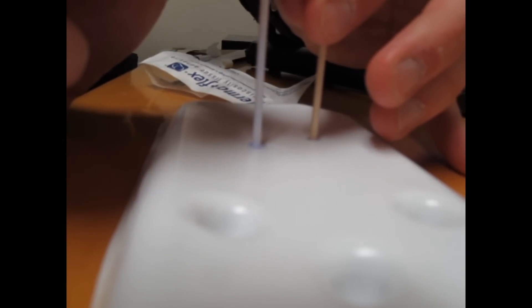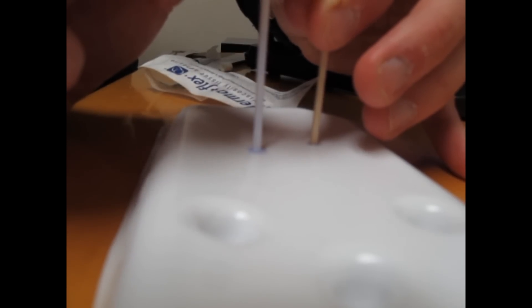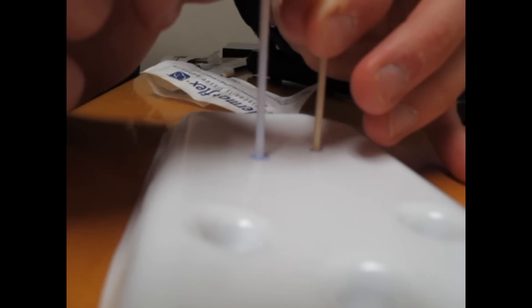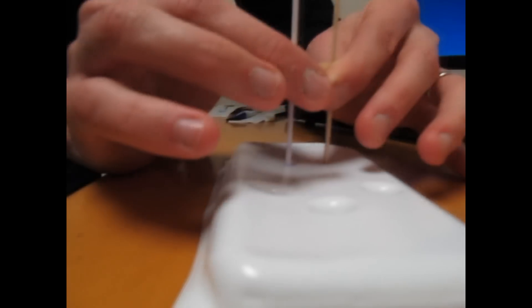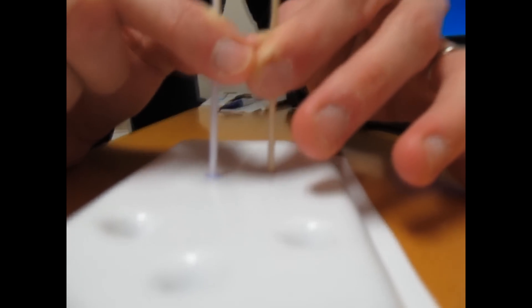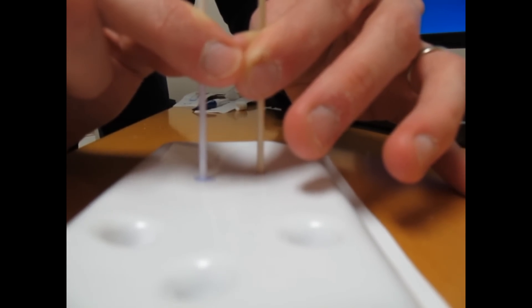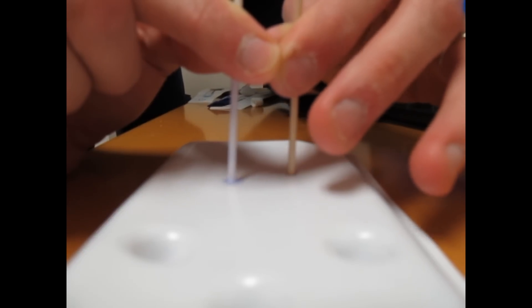How long do we need to hold this? Not sure how long Dermabond usually takes — let's give it about two minutes. We have a patient with a plastic bead stuck in his ear waiting on us, so we wanted to make sure we were using the right equipment.